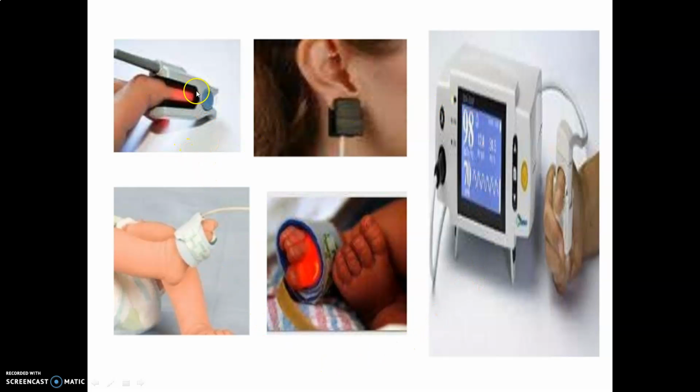This is your fingers, right? Yes, this is your peripheral probe. Okay, how are you attaching it? Have you seen? These are the particular bulbs, and these are the lights being emitted, this red light and infrared. So both are able to detect your oxygenated and deoxygenated blood.